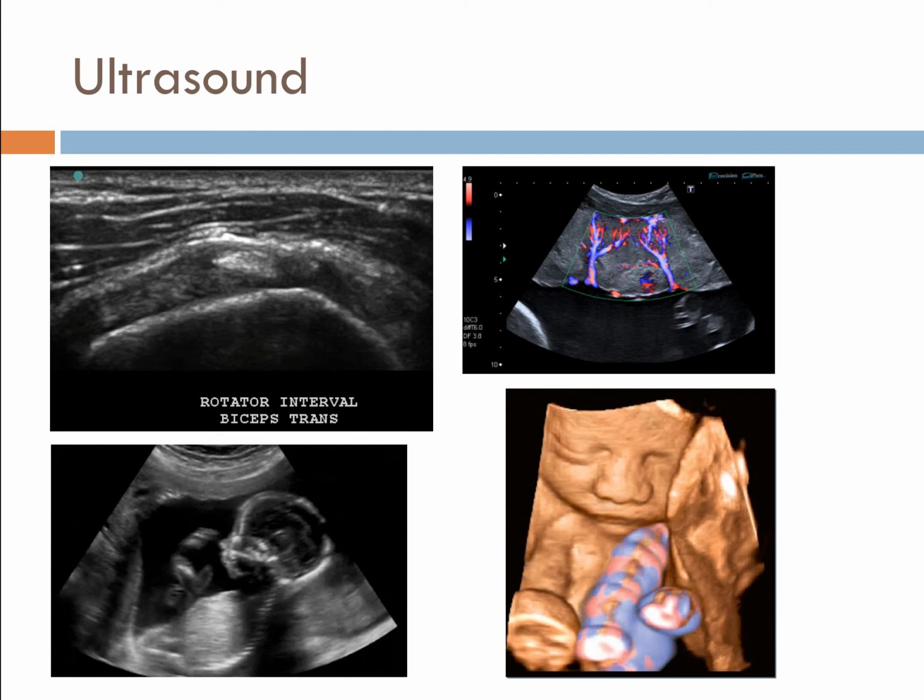There are trucks that go around in the United States and perform MR, and they have set up areas where they can do it, but it's not what you would truly call a point of care option. But ultrasound, you've all seen them before. You wheel them into the room and use them straight away, and they're very, very effective. I was actually having a chat to some of the doctors from some of the elite sports clubs, and they don't see their players.